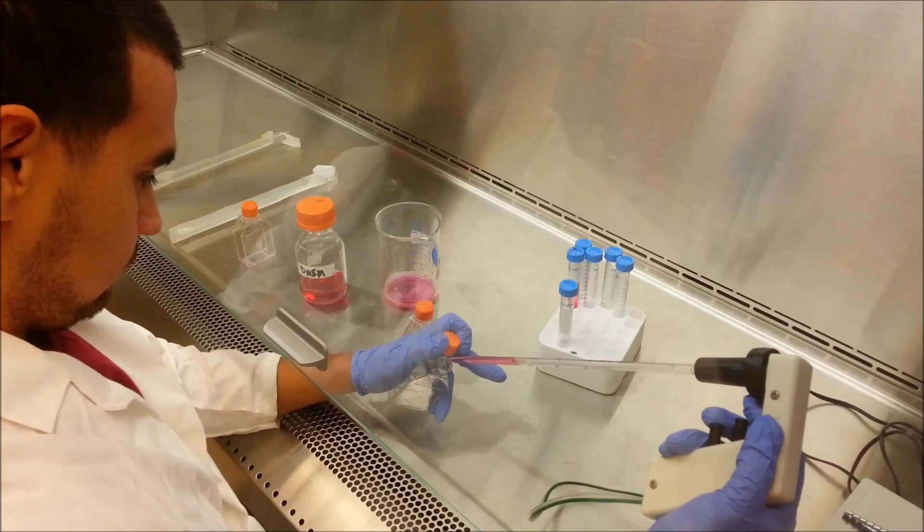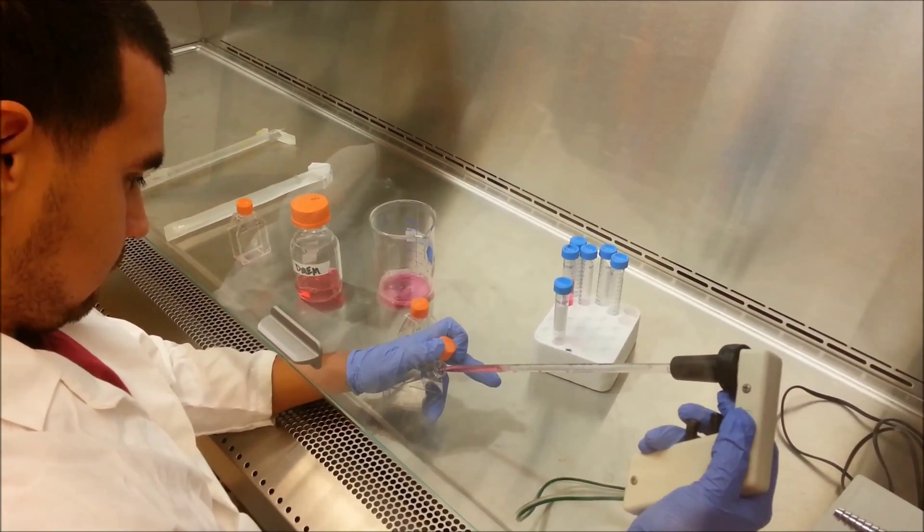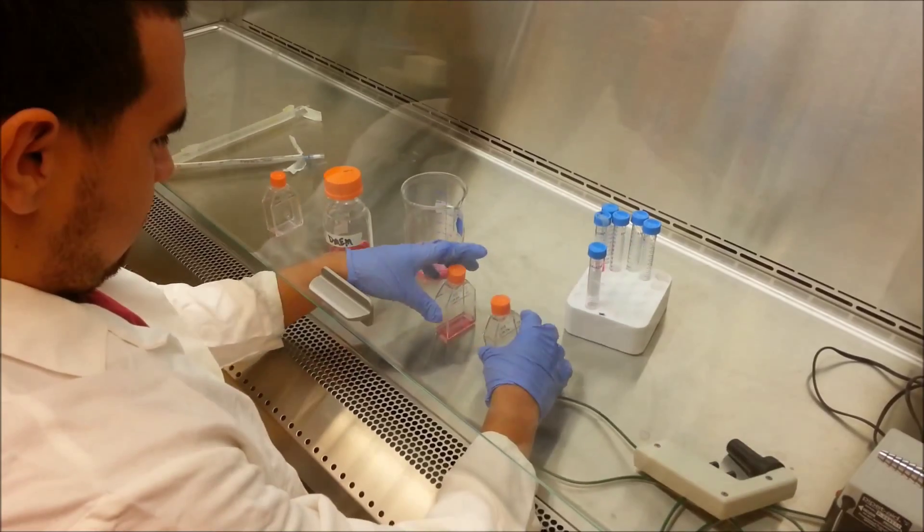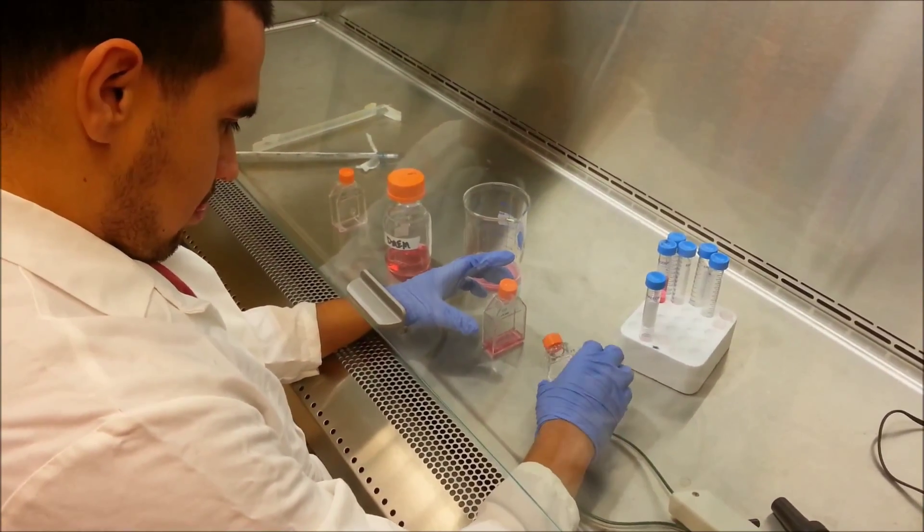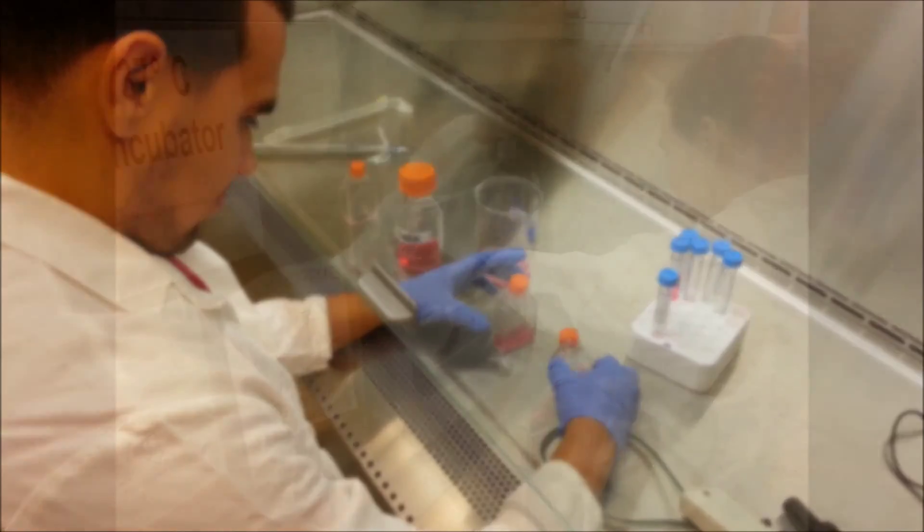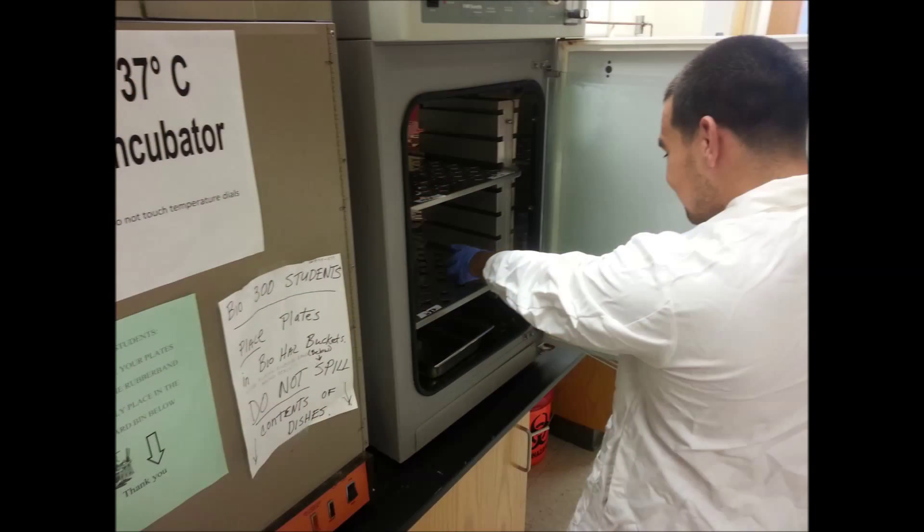Add 3.5 mL of the cell suspension to your T25 flasks. Rock them to ensure that the suspension covers the surface. Place your cells in the incubator.